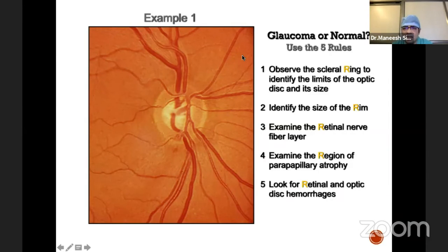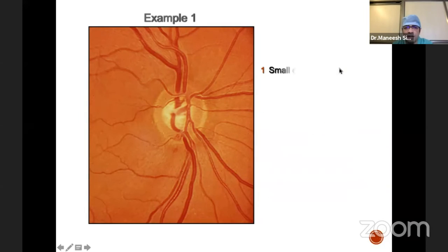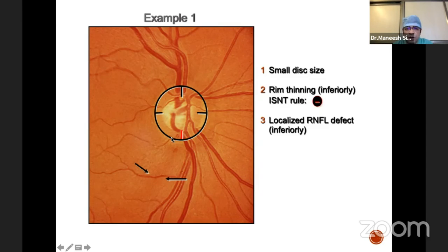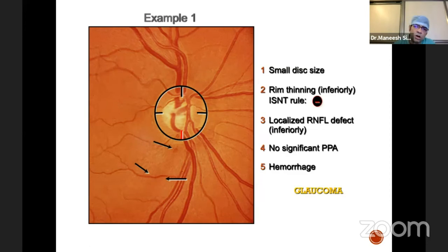Let me share a few clinical examples using the Five R's. First patient: small disc — the first R. You can see rim thinning — the second R. There is an RNFL defect inferiorly — the third R. No parapapillary atrophy, but there is a disc hemorrhage — the fifth R. Multiple signs indicate definite glaucoma, so this is a glaucomatous disc. Second patient: average-sized disc with a healthy neuronal rim, no obvious RNFL thinning, no parapapillary atrophy, and no disc hemorrhage — this is a normal disc.